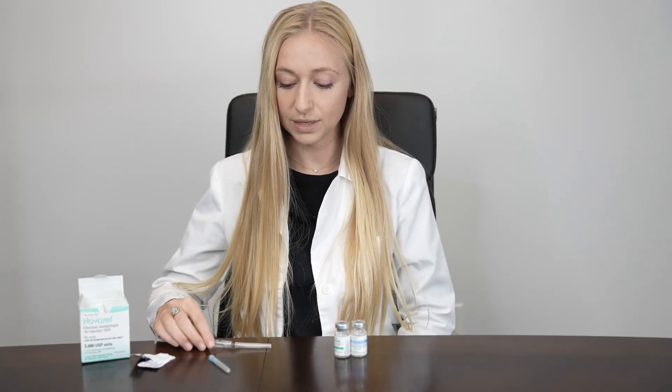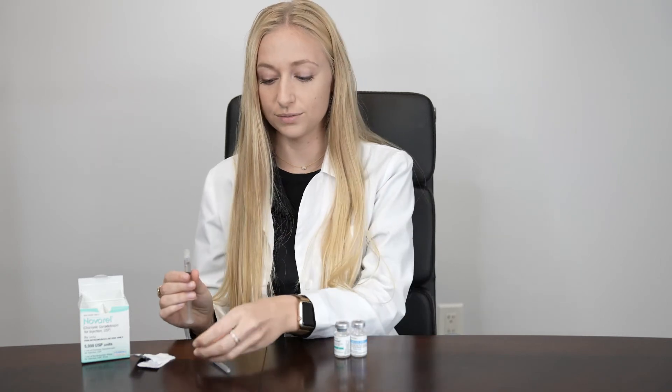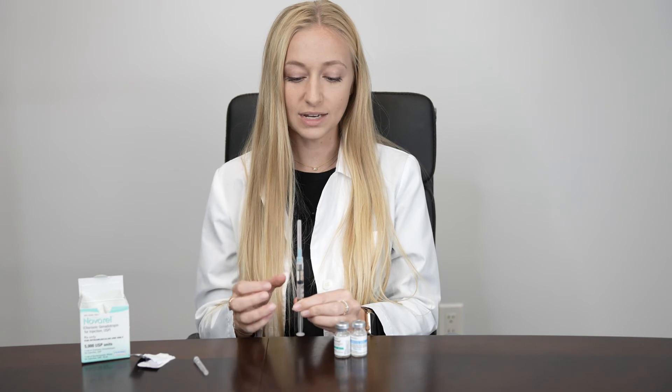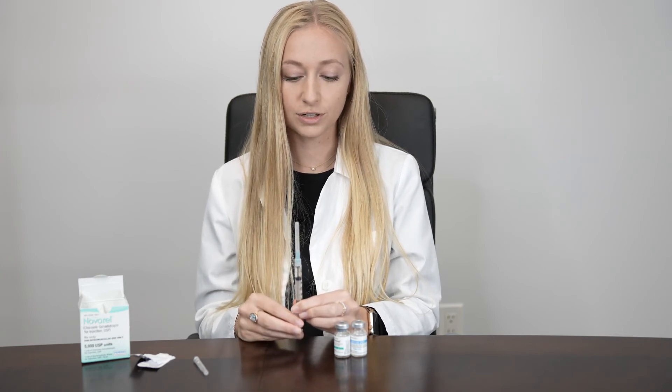Carefully recap your mixing needle and exchange it for your injection needle. This is going to be a 1.5 inch 25 gauge needle. With your syringe facing upward, gently tap to expel air bubbles towards the top and then push on the top of your plunger to expel all the air.